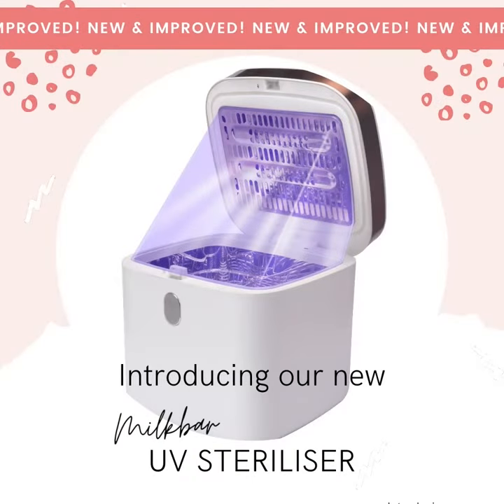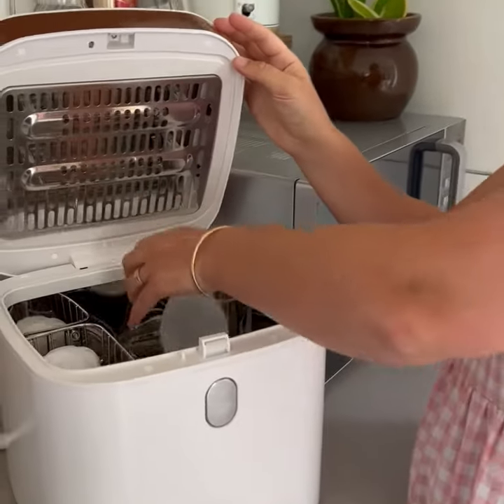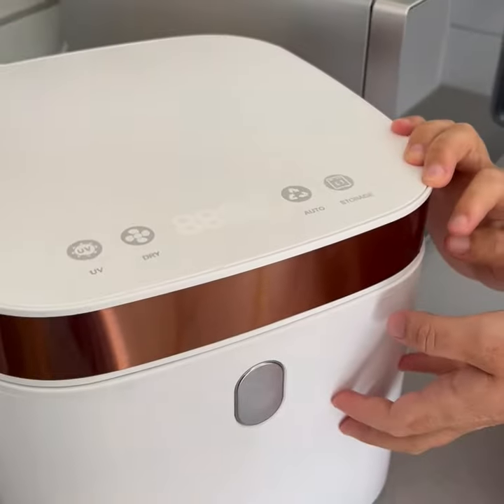Introducing our new Milk Bar UV Steriliser — a safe, gentle and effective sterilising system. Now with a huge 10 litre capacity and two powerful UV lights, so you can sterilise faster than ever.